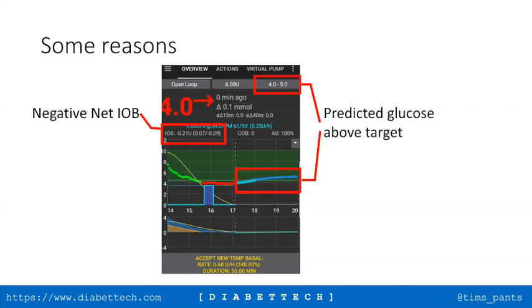So is it still worth increasing your glucose target half an hour after coming out of hypo? So what I would suggest you do before we even get there, how frequently are you finding that you are going low? Because you did mention earlier on that you were seeing that quite a bit. Yeah, well, 3 fits this week. Yeah, quite often.